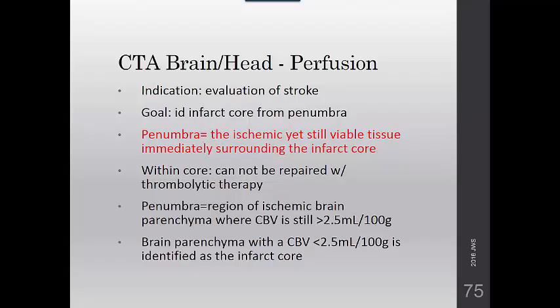They're CT perfusion to determine cerebrovascular reserve and CT perfusion in conjunction with temporary balloon occlusion. I encourage you to read over those, but I won't test you on them. I don't know how much of that you'll see on the registry as well.